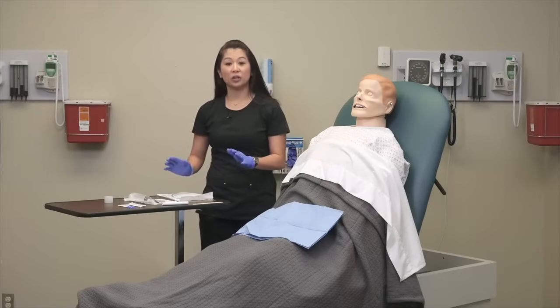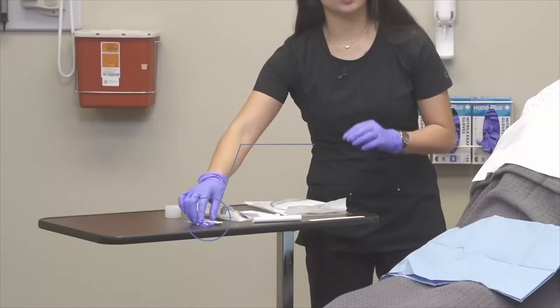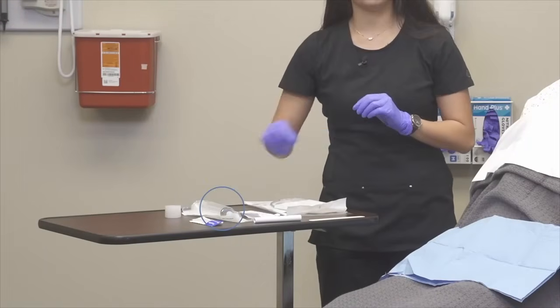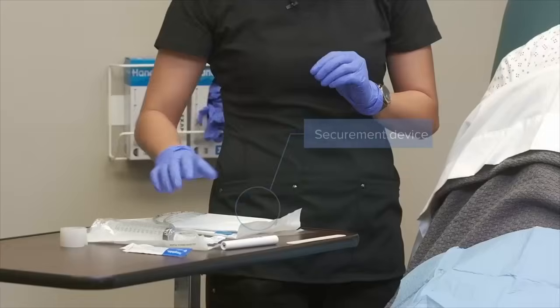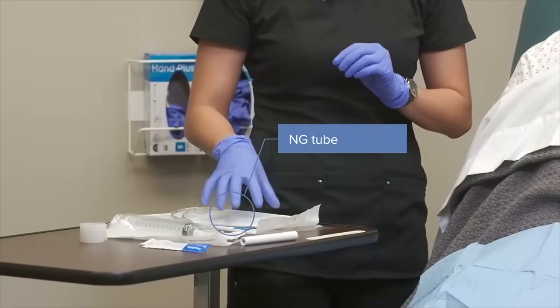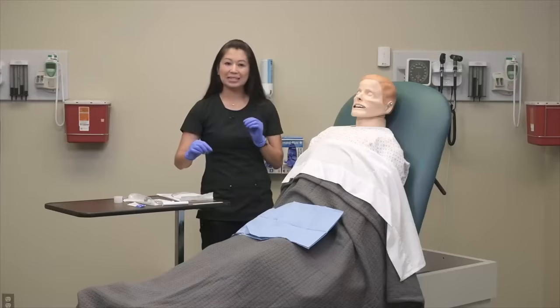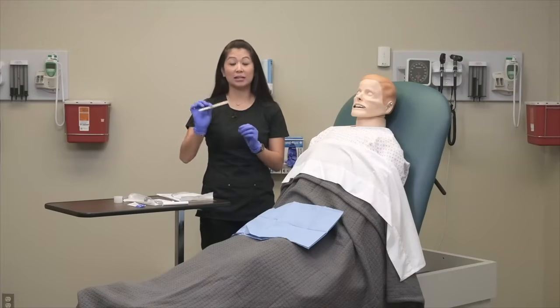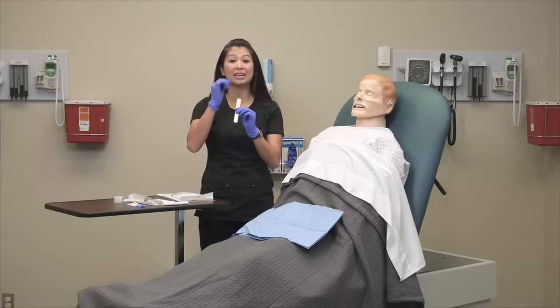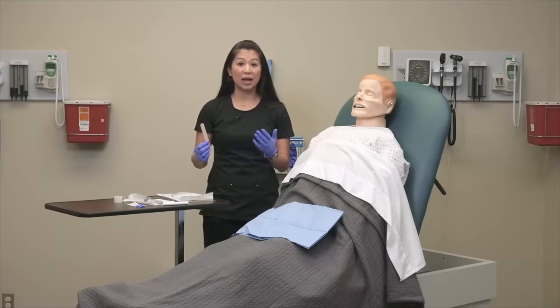All right, so let's take a look at the equipment that we've got here. I've got a little tape for a marker, our lubricant, and our piston syringe. I've also got a nasogastric securement strip, our nasogastric tube, and I'm using the Salem sump today. Also my pen light for visualization, and sometimes if you need to look inside the patient's mouth, it's handy to have a tongue depressor so you can push down their tongue and take a look inside their mouth. If you have some help, anytime you place a nasogastric tube, it's always great to have a second set of hands.